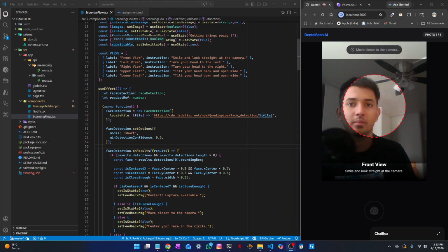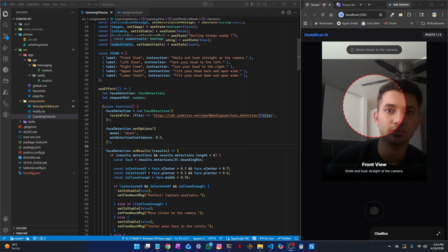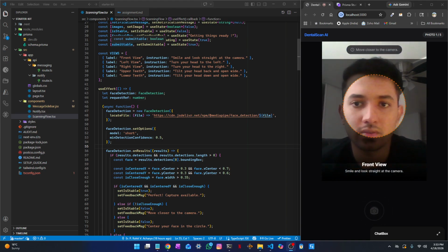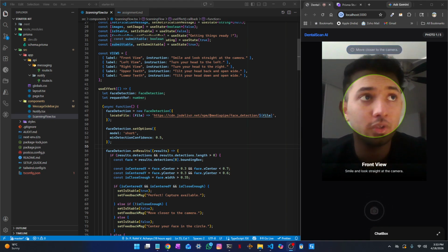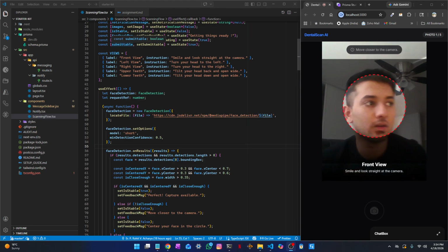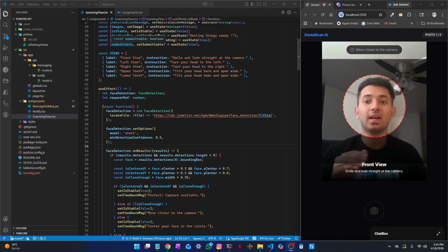And here I'm trying to demo this. So whenever the user moves a little far, it will actually show the user to move closer to the camera. And if the user is flickering, I mean, yeah. So as soon as the user comes into the picture, this will actually show the user that he or she can click the picture, and then there's also this shutter button that will be enabled only when the user's profile is completely filled.